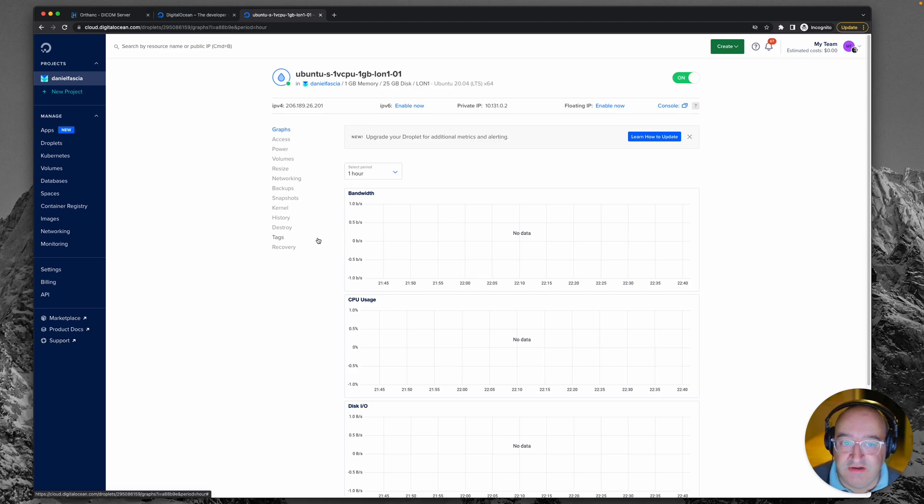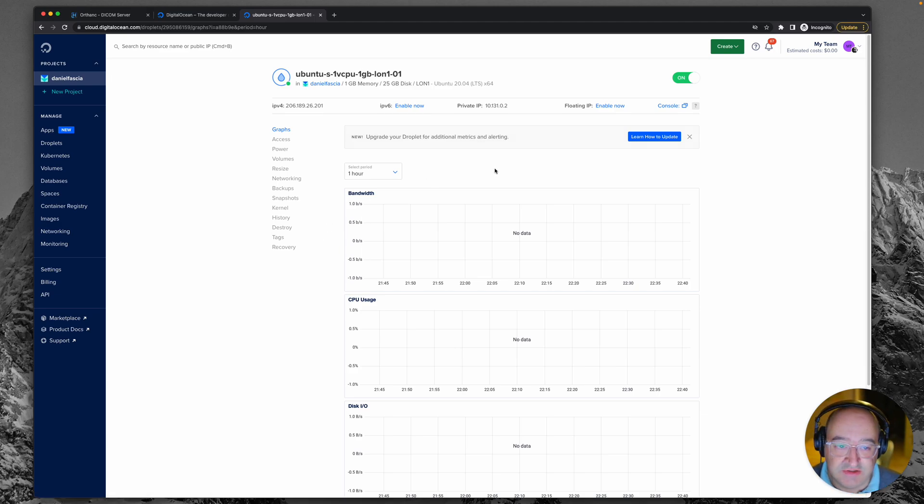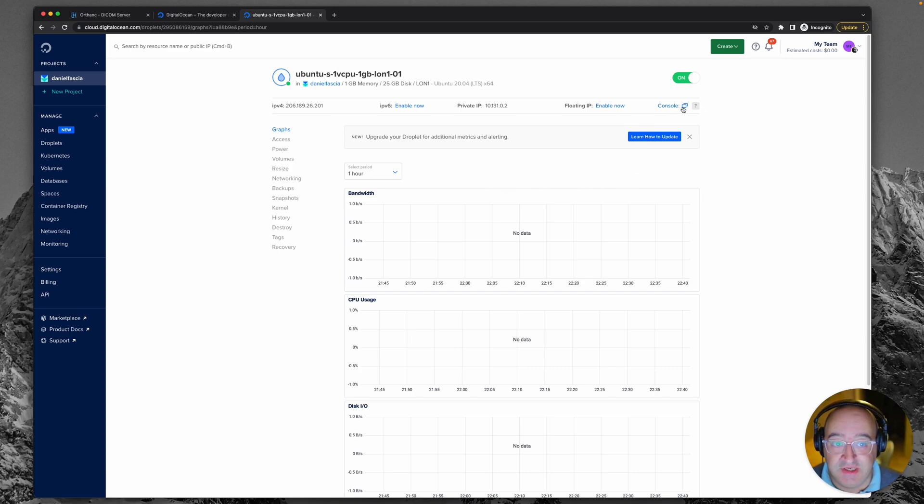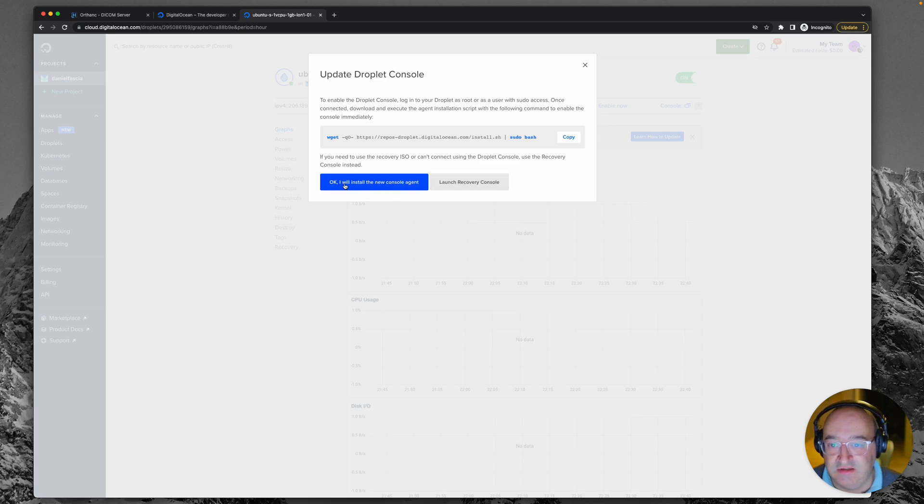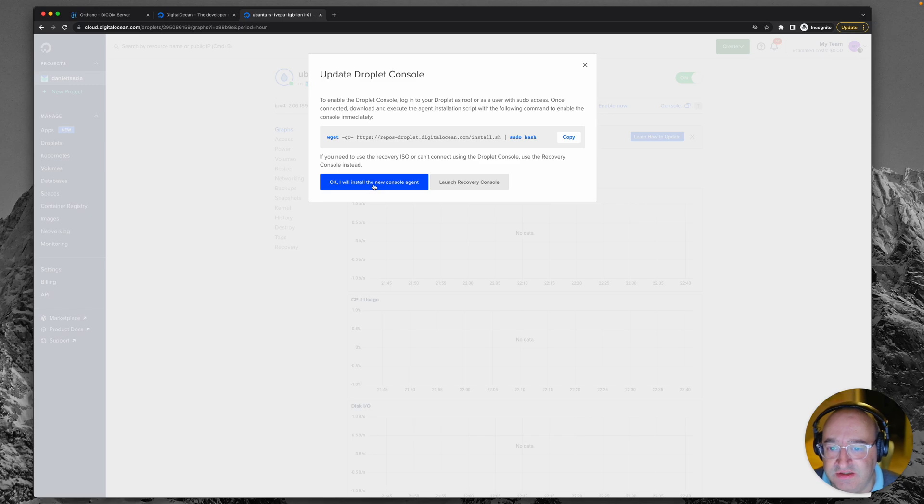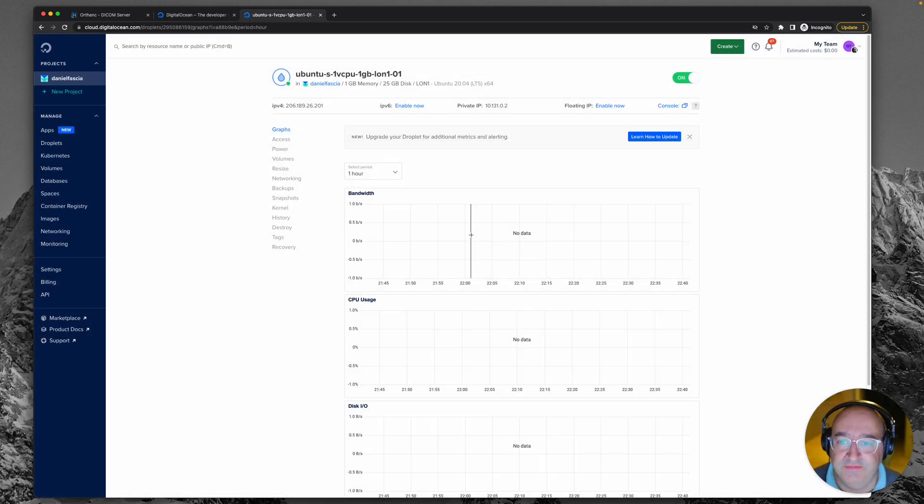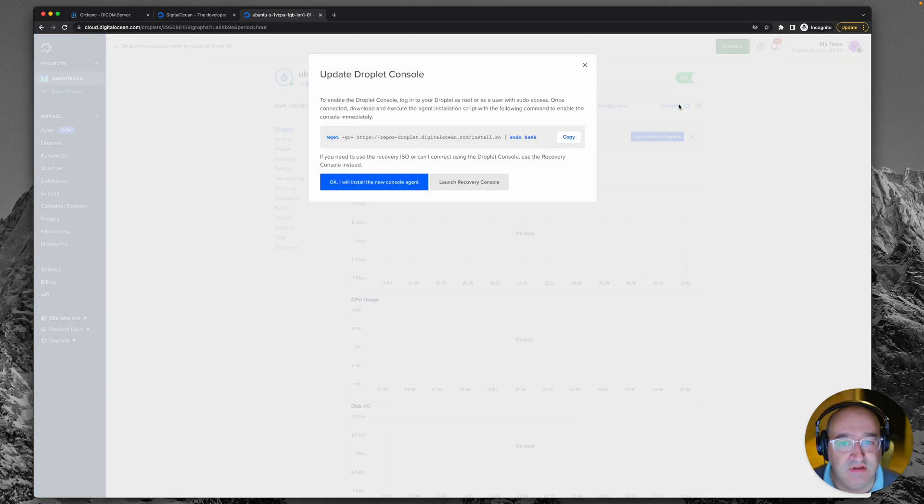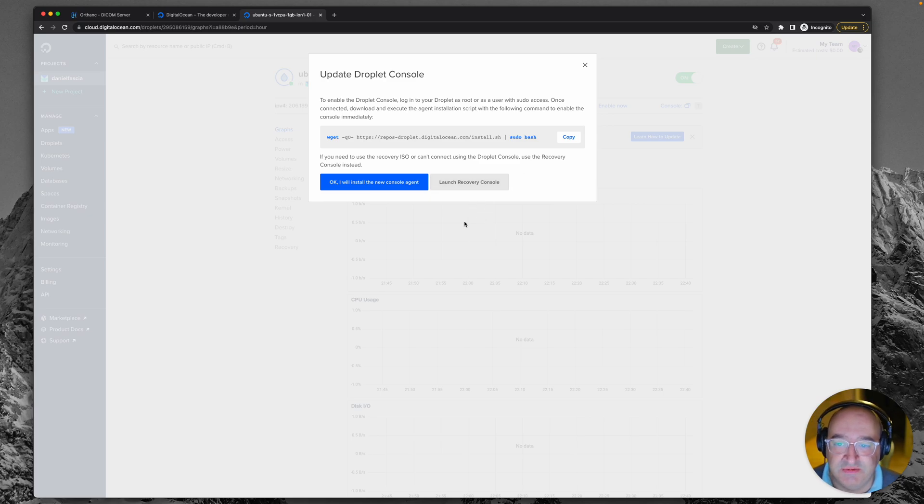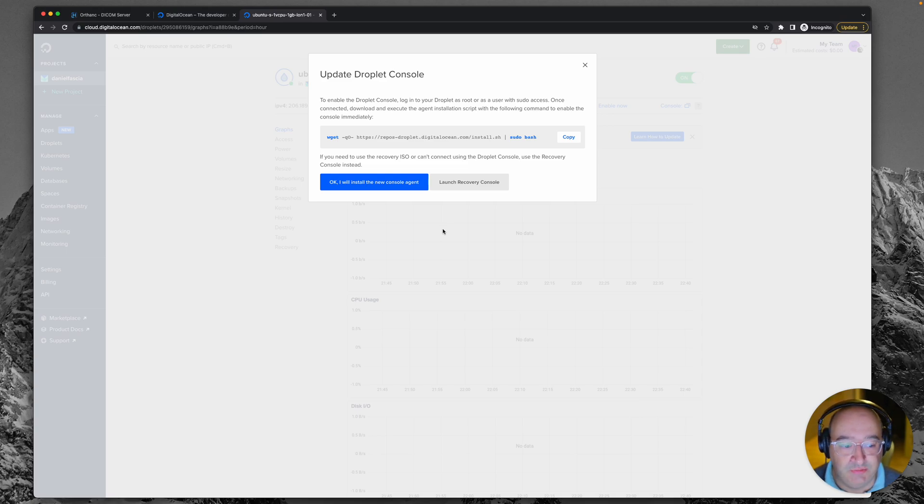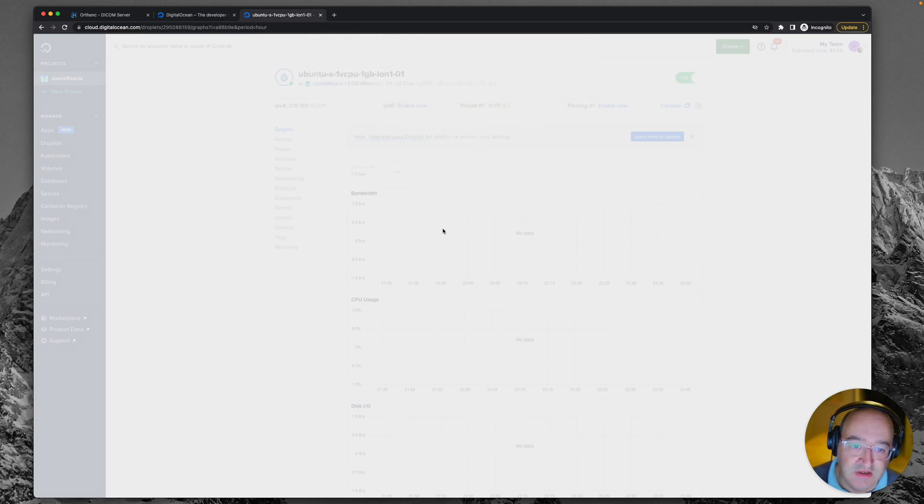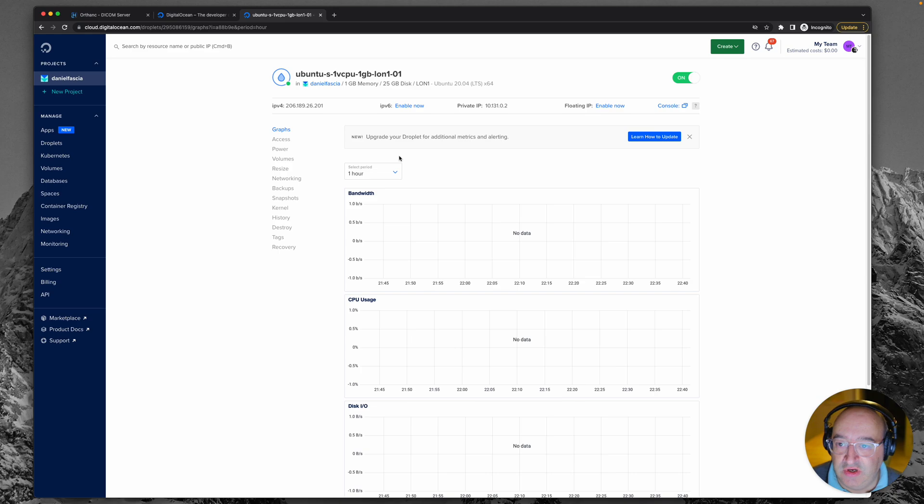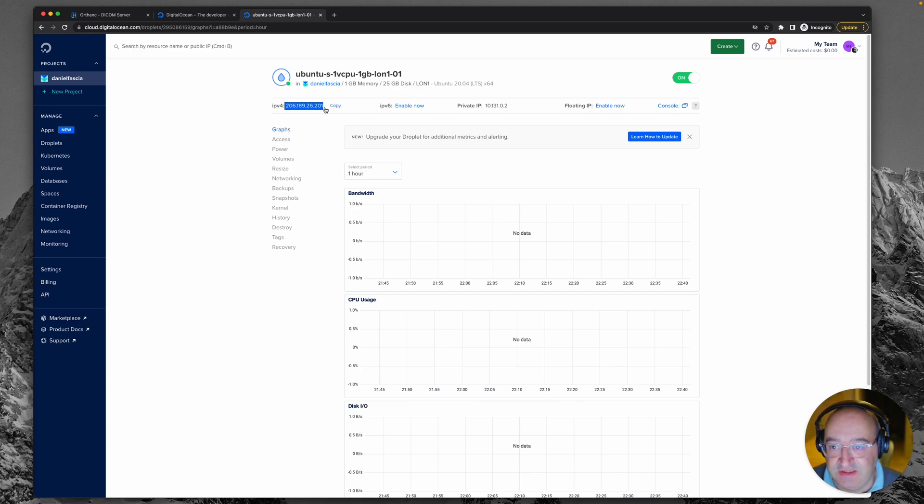So now what we're going to need to do is connect to it. There is a really simple way to connect to it by just clicking console. It's asking us to install the console agent, saying you need to do some mods before you can do that. Let's not do that because I want to show you a much more robust way. You're going to need to make a note of the IP address which is this part here because that is necessary to connect.